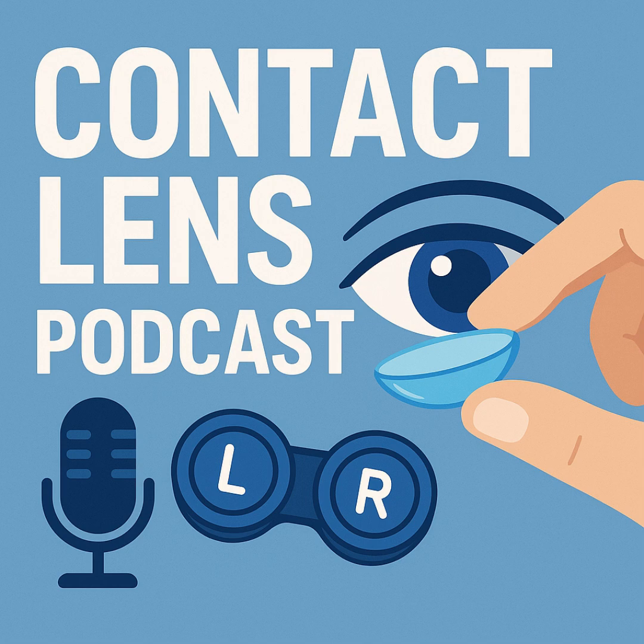Ah, that's the clever part. They use different design tricks. Maybe thin zones, top and bottom, or thicker areas. Some even add a tiny bit of weight, ballast, they call it, to help it settle correctly and stay stable when you blink. So the fit is extra important. It's absolutely critical for torics. It affects how stable that lens is on your eye.